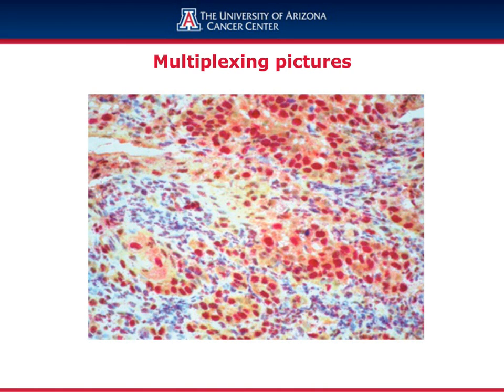It also allows for protein-protein interactions. Here is an example of a multiplexing picture with RedMap kit and purple and blue counterstain.